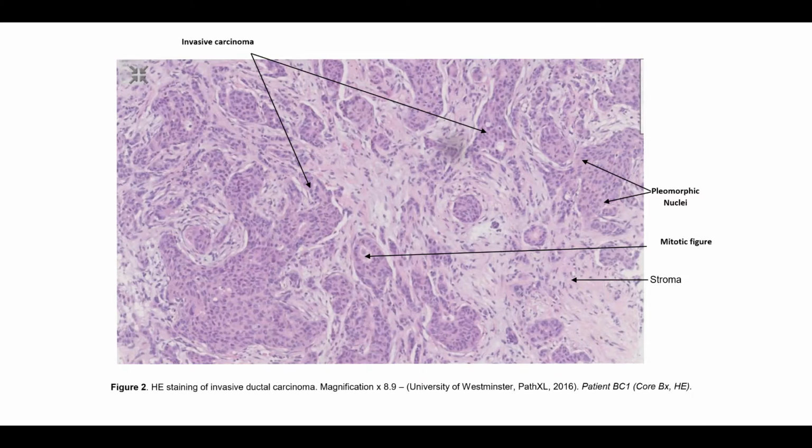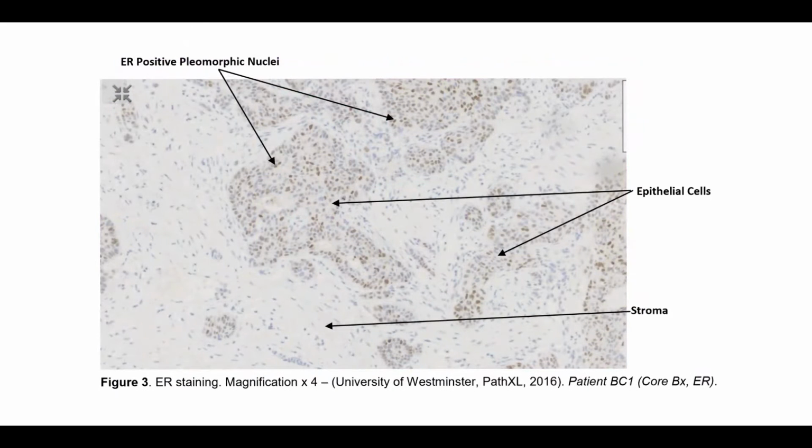The ducts are not differentiated and are not distinct from the stroma, apart from the low quantity of collagen seen demonstrating stromal tissue. The patient should not have many lobules nor ducts within her breast, as she is postmenopausal. Postmenopausal breasts have a reduction in glandular tissue with a relatively increased stroma, which is not seen in this core biopsy.